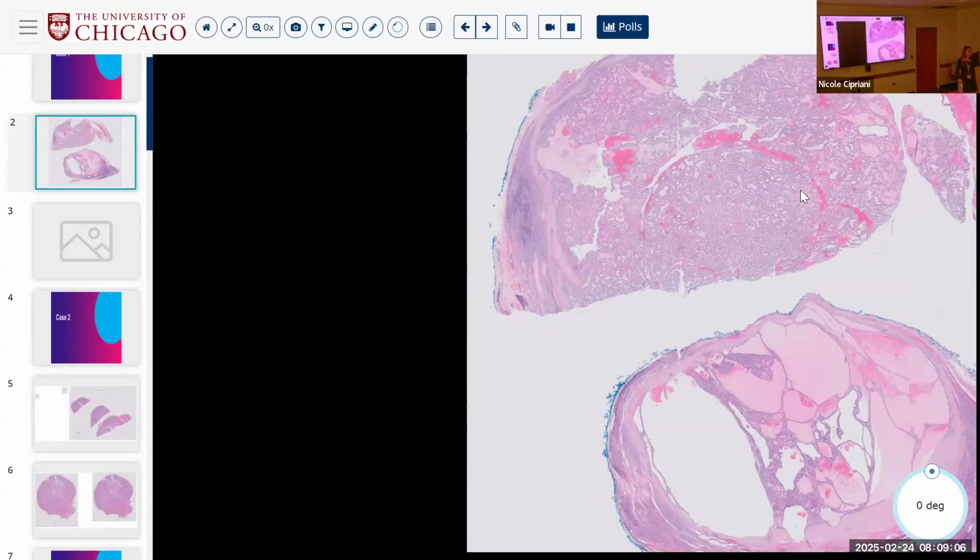What we do, regardless of whether you end up calling this a circumscribed PTC or a weird RAS-like tumor, what do you think the patient's going to behave like? Are they going to metastasize to nodes? No. Are they going to metastasize to visceral sites? No, because there's no angio invasion. What's going to happen to them? Probably nothing, right? So the point to come across is in the absence of intrathyroidal invasion, in the absence of angio invasion, they're probably going to be non-metastatic, and they are probably going to be observable, right?